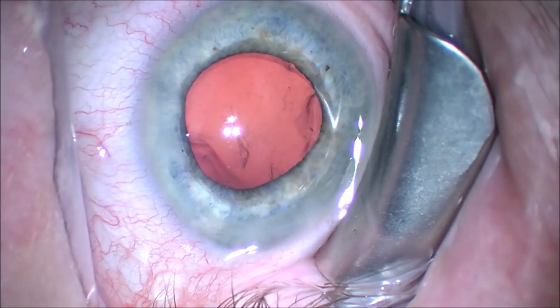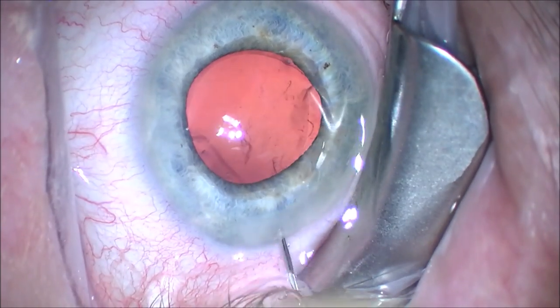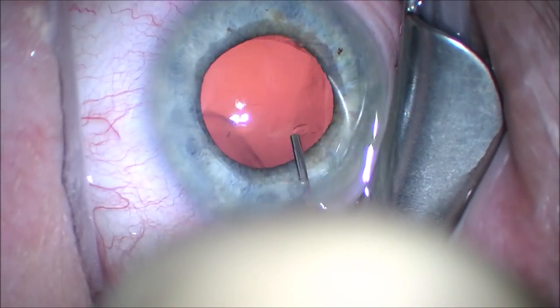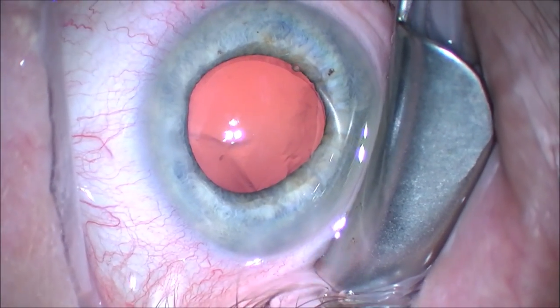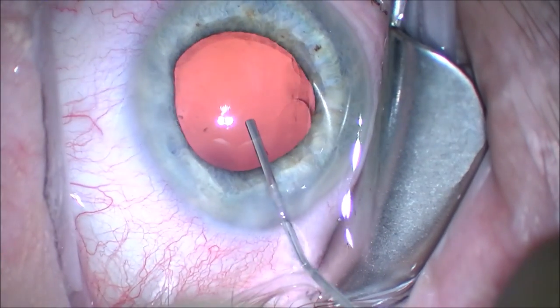This leaves us with little capsular strands on the posterior capsule, which we'll remove with balanced salt solution, just kind of hydro-dissecting them off the posterior capsule. This is easy and safe, and I've used this now in probably 3,000 cases without any capsular rupture.